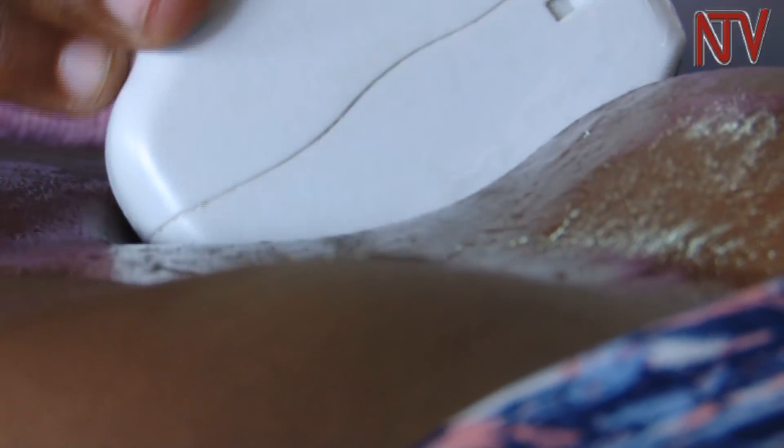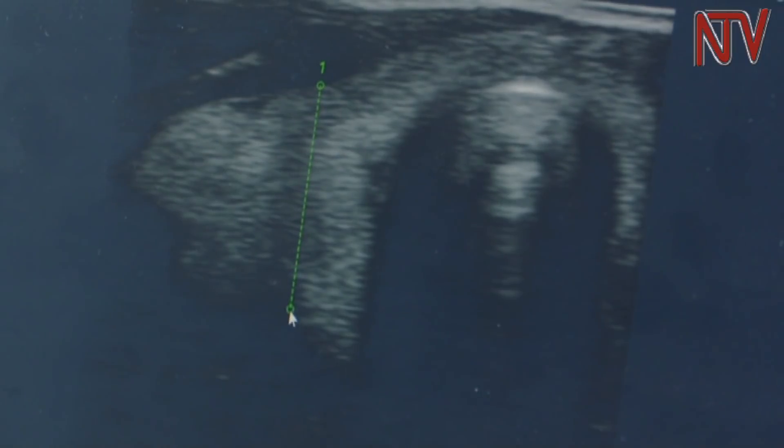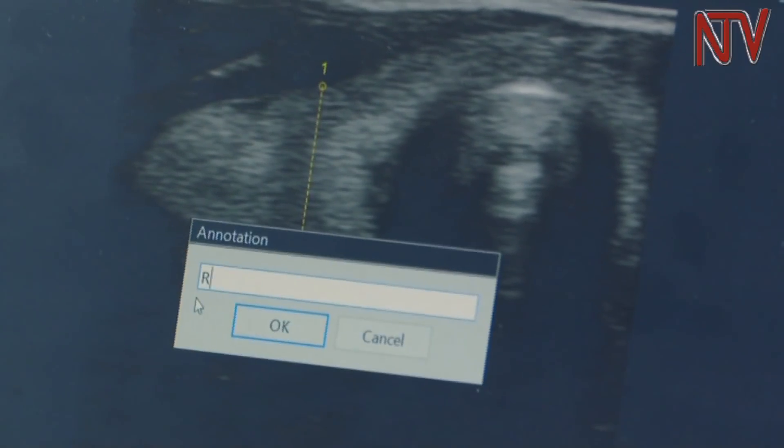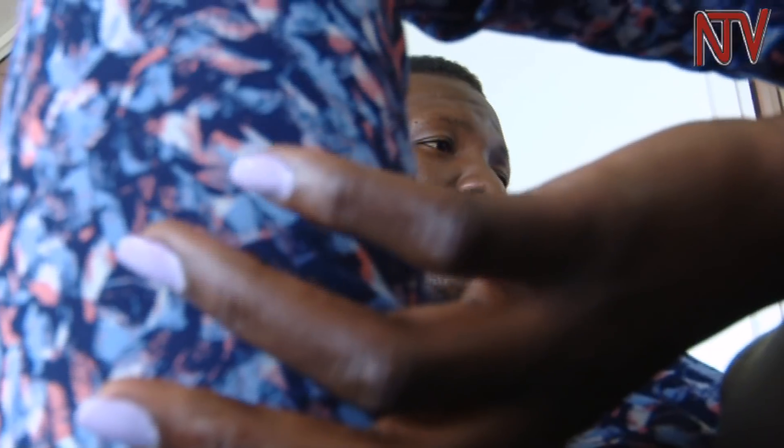In the process of scanning, the radiographer is able to measure the length and size of the organs. Most of the organs have a range within which we consider them to be normal, so by taking different measurements we are able to know that the liver is normal, the kidneys are normal, and the spleen is normal.